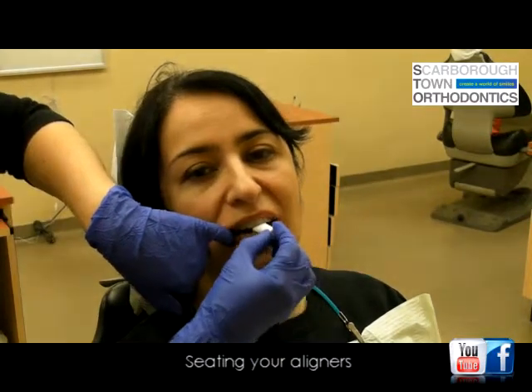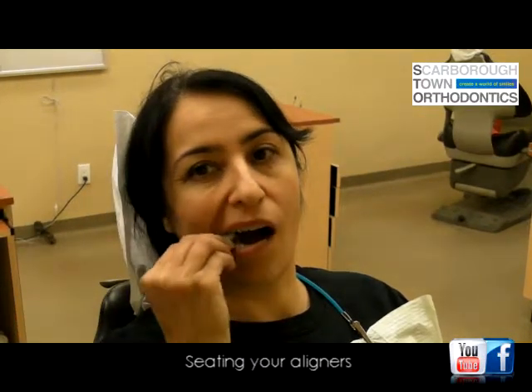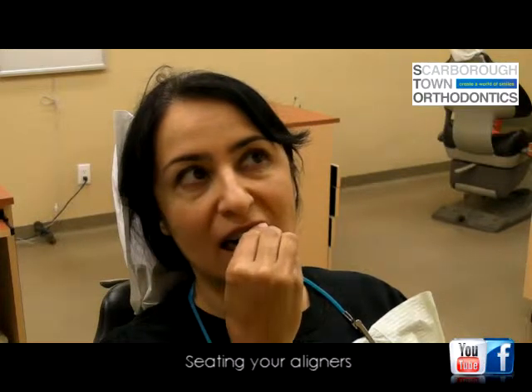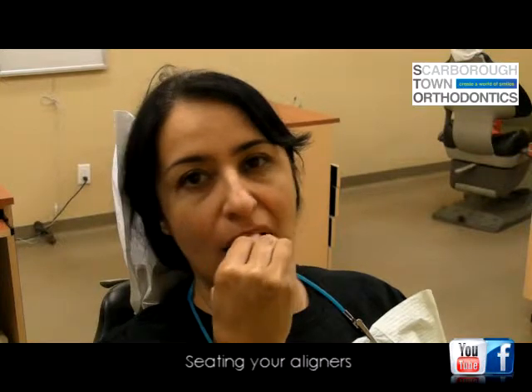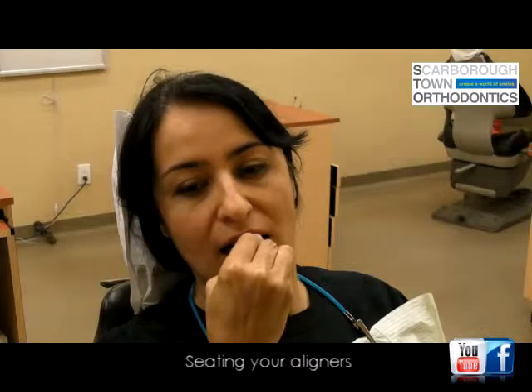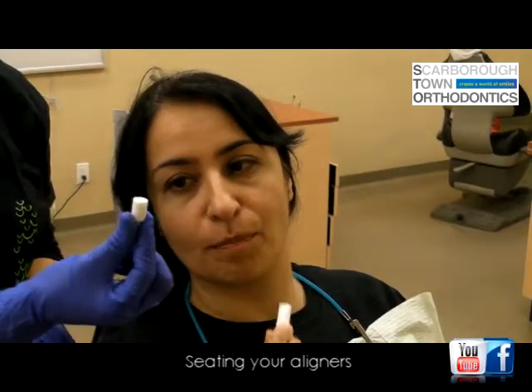And once a day you're going to use this chewy to chew for about 5 minutes. And this is a type of exercise that is for your teeth. It basically helps to improve circulation to the bone and the gums, and this will help your teeth actually move faster.